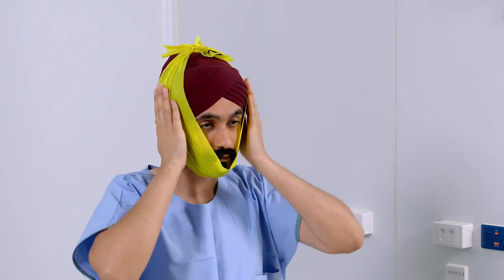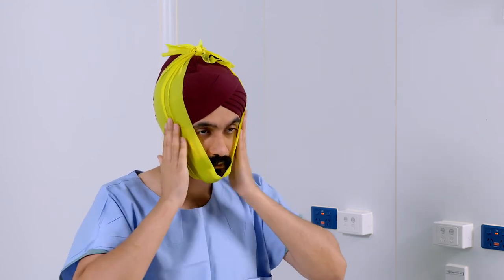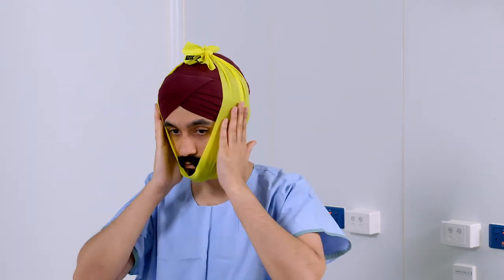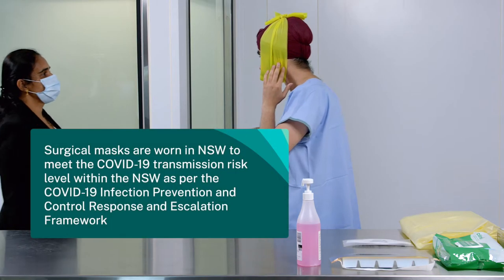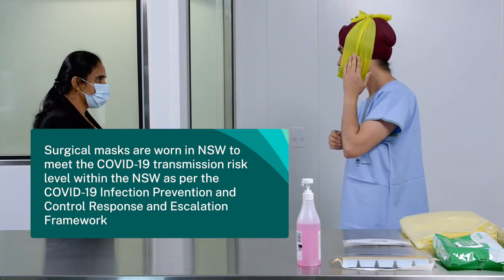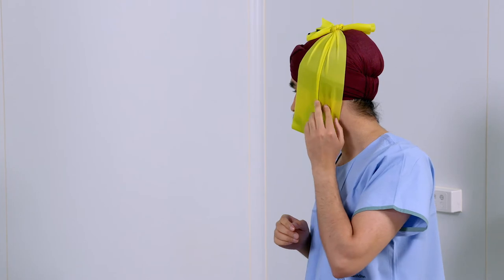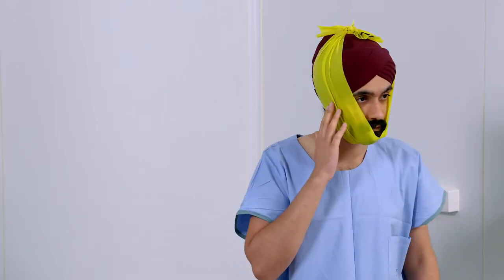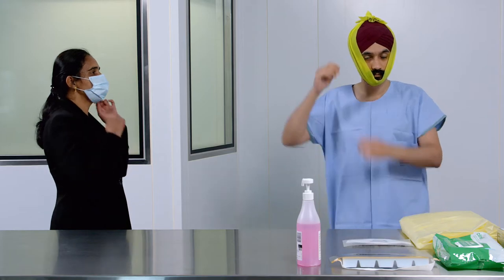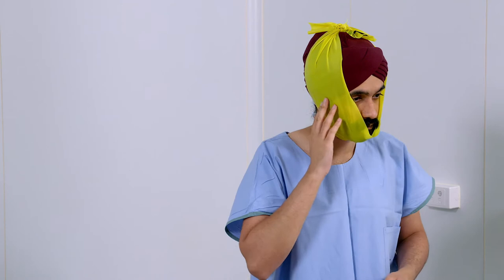Ensure that all facial hair on your chin, cheeks and neck are covered by the elastic band and it does not cause restriction or discomfort around the eyes and mouth. Use a mirror or ask a donning buddy to check the fit of the elastic band. The band should be stretched under loose tension, but not too tight to cause discomfort or restriction. The band must be smooth with no folds or wrinkles.